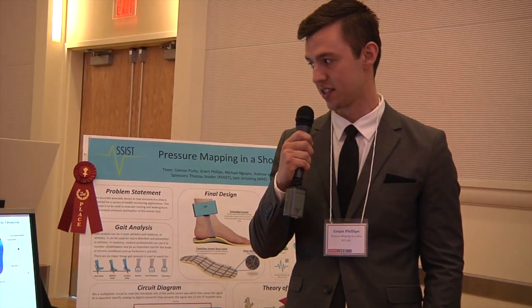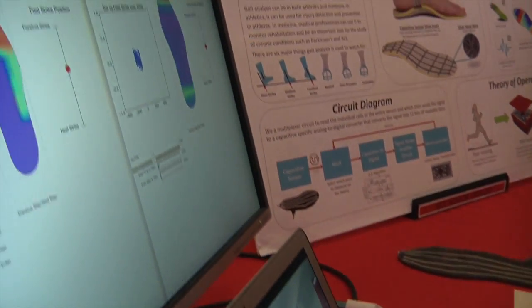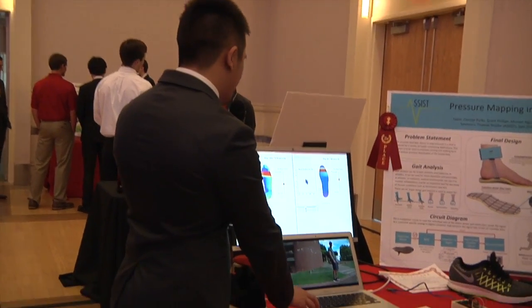Once we collect the data, it goes to post-processing. In terms of gathering our data, we interfaced everything on the computer through Python. Python was good for working with large amounts of data, processing everything, getting it clean, and automating it to display on a heat map that we have on the screen.